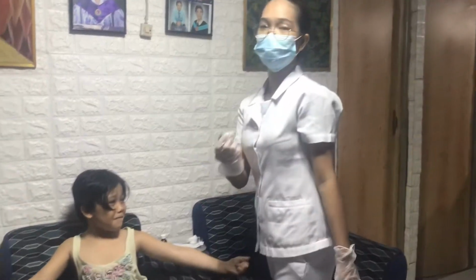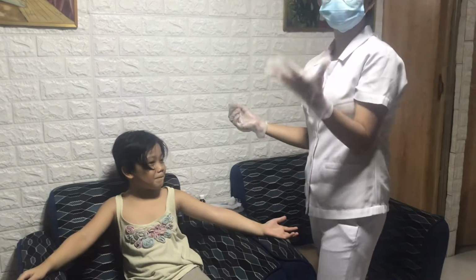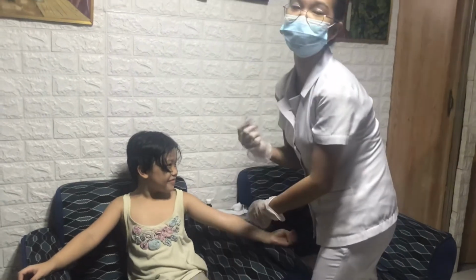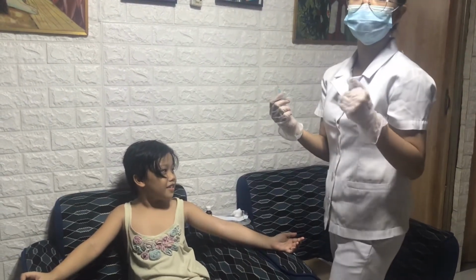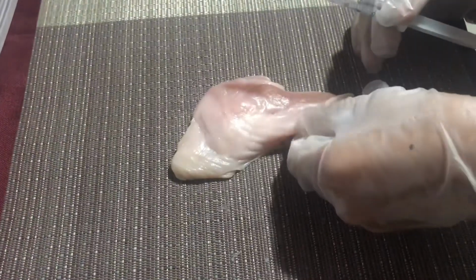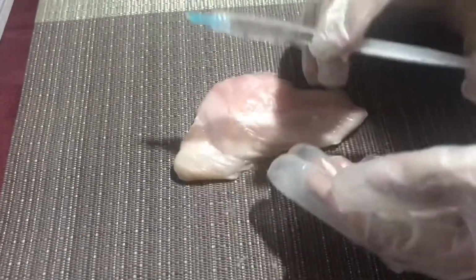After removing the cap and holding the syringe, the next thing to do is stretch the skin with the non-dominant hand. The rationale for this is that taut skin provides an easy entrance into the intradermal tissue. After stretching the skin taut at the injection site by pulling gently with the thumb and forefinger of your non-dominant hand, the next step is to bring the needle very close to the patient's skin.